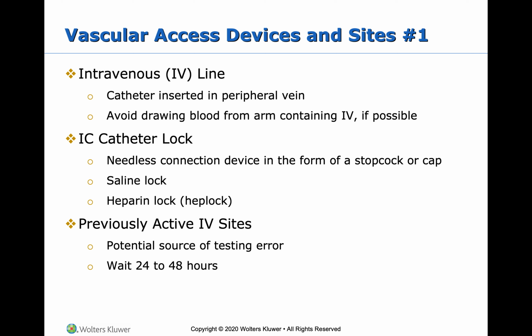Once they're done collecting the blood, they're going to flush the saline or heparin lock again, because if stagnant blood is left in that tubing, it can actually clot, and then they won't be able to administer fluids or medication or draw blood from that site again, because it's going to be clotted up. In that case, basically the IV is bad and they will have to start a new one. It's actually happened to me before. No, it's not our job to draw from these and to ensure that they're flushing them.